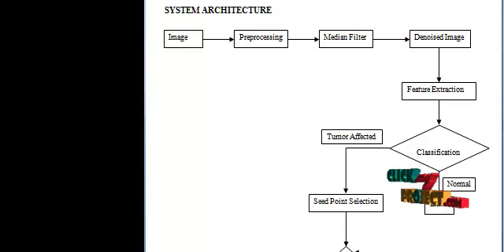At each stage for each region, we check if there are unclassified pixels in the 8 neighborhood of the pixels on the region border. Before classifying, the region homogeneity is verified. Two regions are merged on the basis of the arithmetic mean and the standard deviation. By comparing the values to the seed points, the values are matched, and if the values come under the threshold, then the regions are combined. Thus, the single selected regions are grown in order to get the overall tumor affected regions.